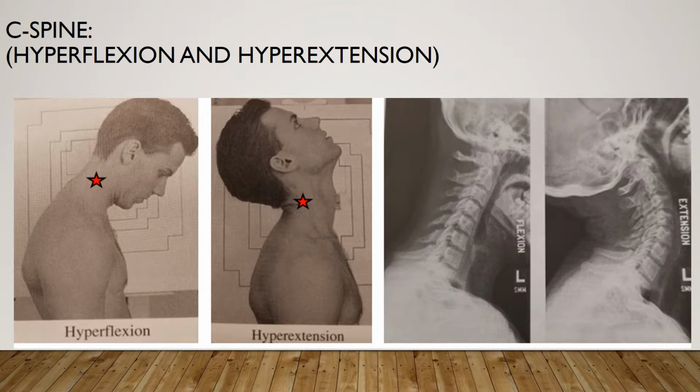With hyperflexion, you want to see the spinous processes well separated. With hyperextension, you want to see the spinous processes in close proximity. You want to have optimal density and contrast with no motion. Soft tissue margins are visible and trabecular markings are sharp.